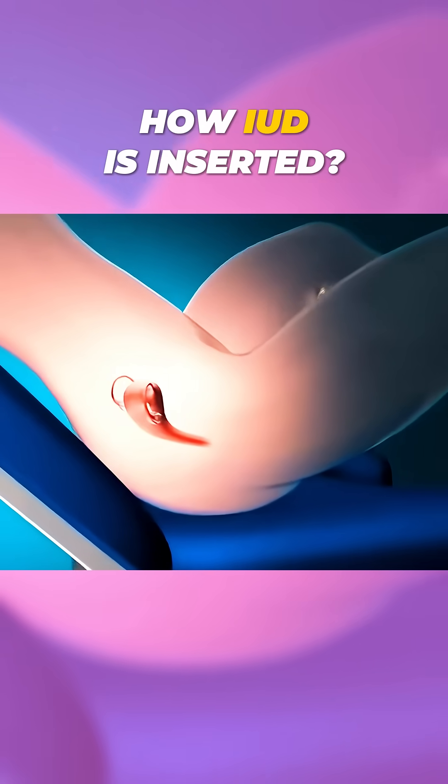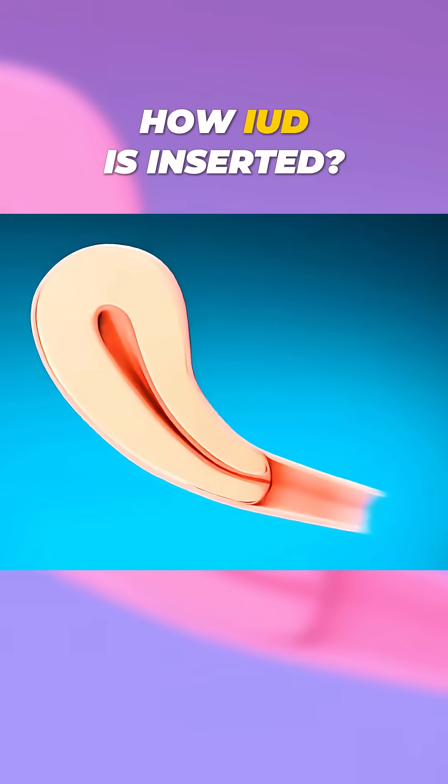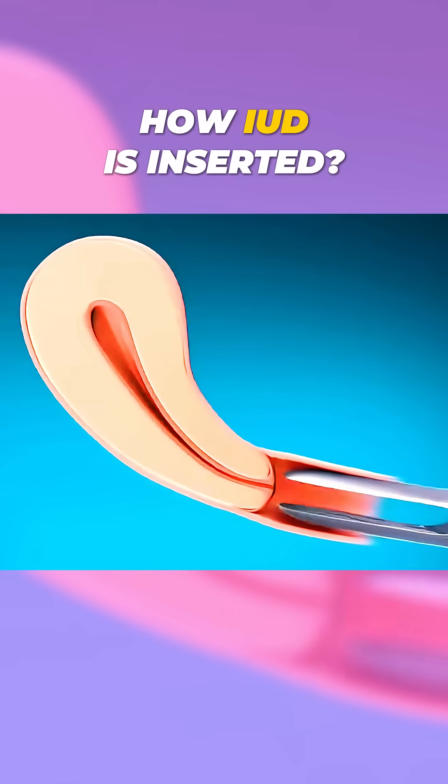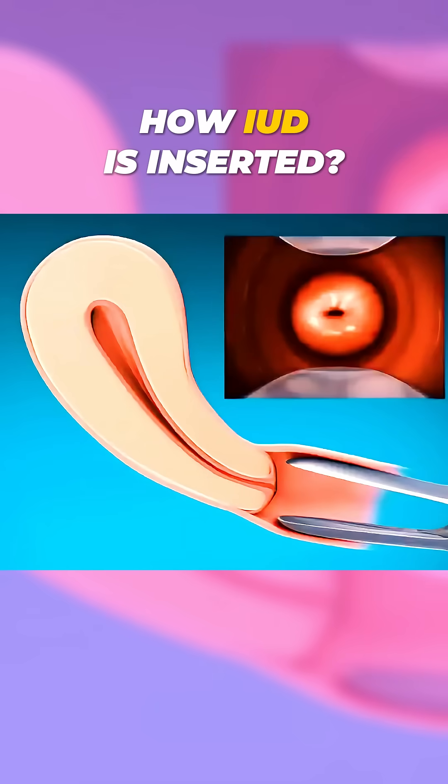Ever wondered how doctors insert an IUD? Here's a quick look at the process. First, the doctor checks the patient's uterus for size, position, and any signs of infection or pregnancy.